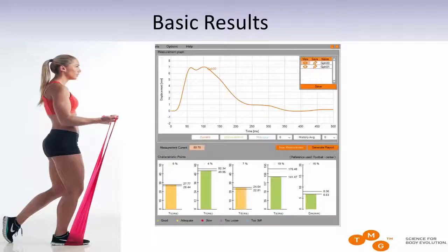The only limitation probably is if the muscle is so very small that you cannot isolate it and you cannot put a sensor on it, you cannot measure it. So if you would try to measure some flexors of the fingers individually, you can't. But you can measure them as a group. So these are, again, the most frequently measured muscles.